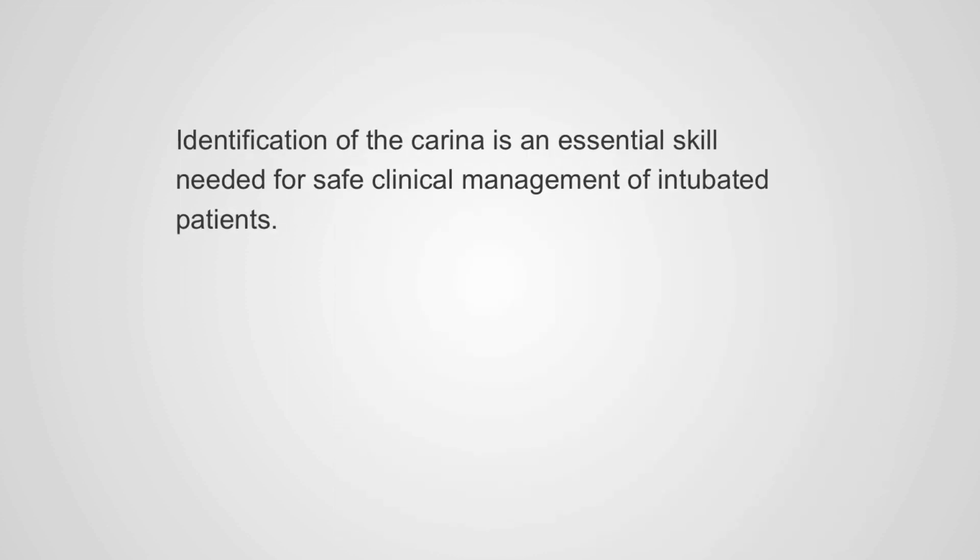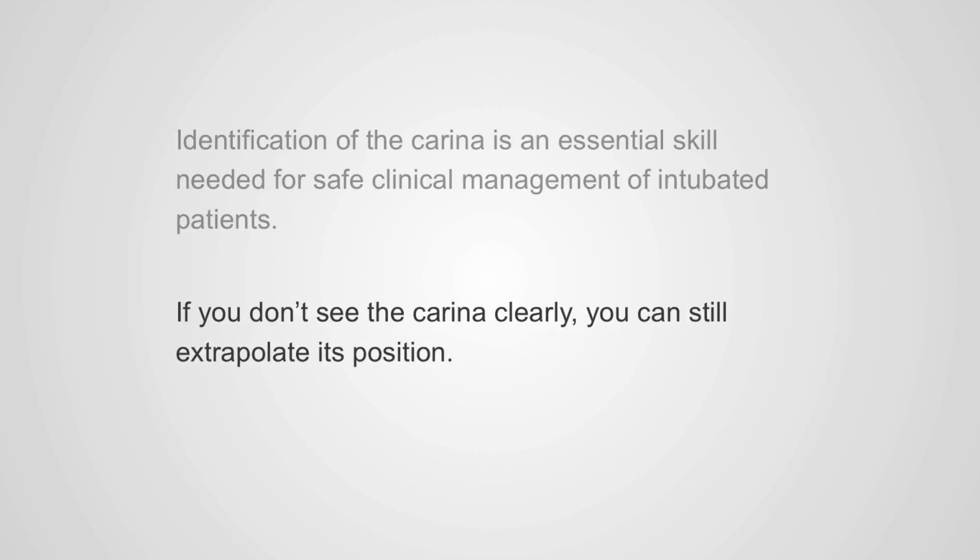So in summary, identification of the carina is an essential skill needed for safe clinical management of intubated patients. If you don't see the carina clearly, you can still extrapolate its position.